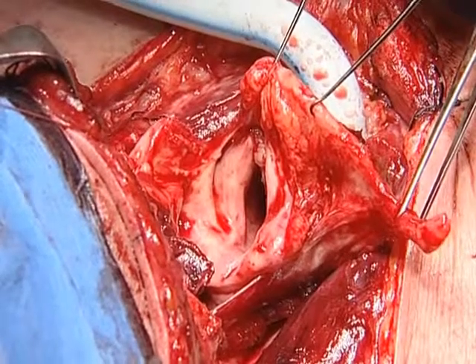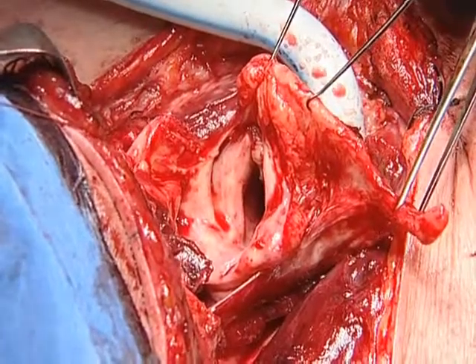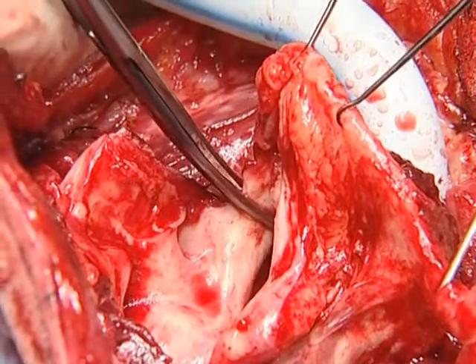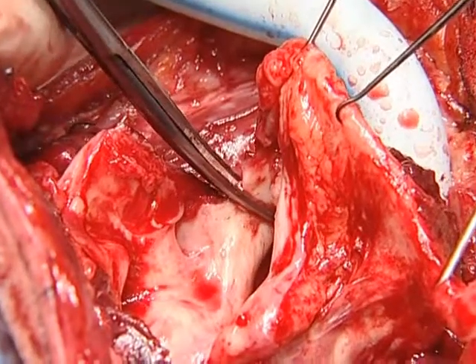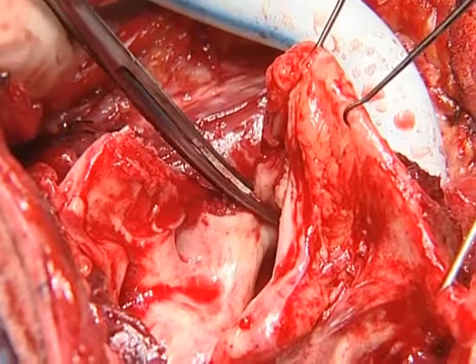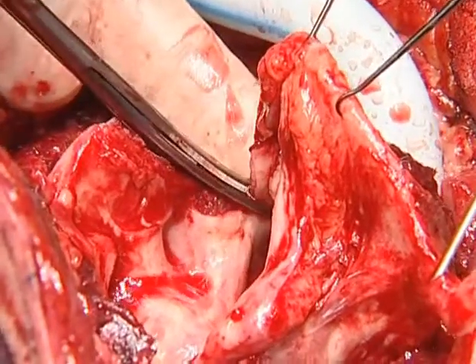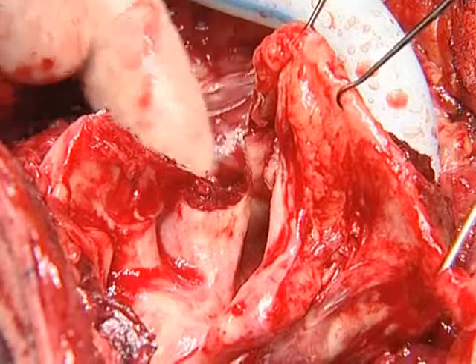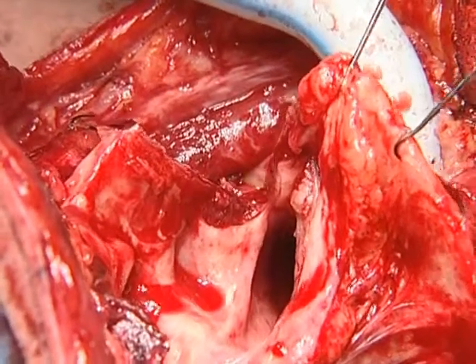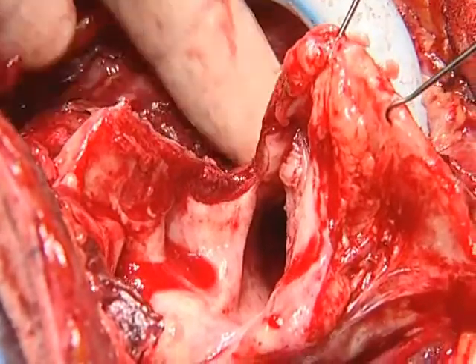Now, the anterior incision can be placed under direct vision of the tumor. The anterior commissure is included in the resection and the anterior incision is placed through the vocal folds at the left side.